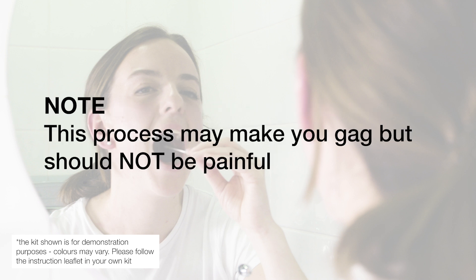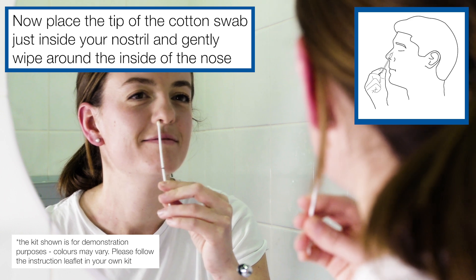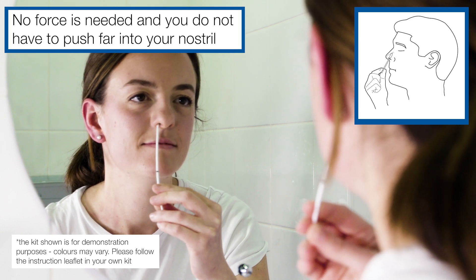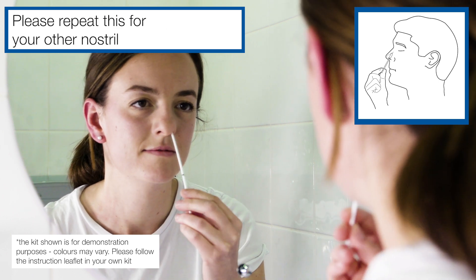Note, this process may make you gag, but should not be painful. Now place the tip of the cotton swab just inside your nostril and gently wipe around the inside of the nose. No force is needed and you do not have to push far into your nostril. Please repeat this for your other nostril.